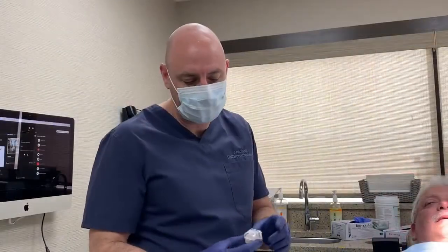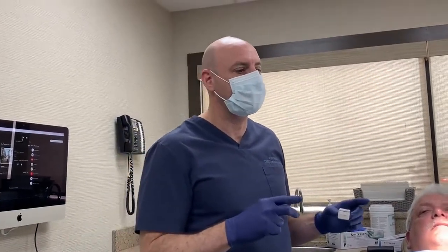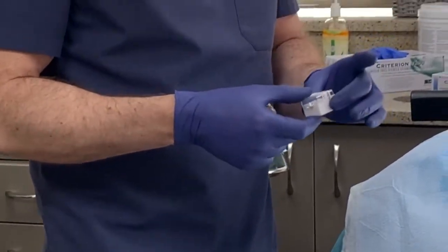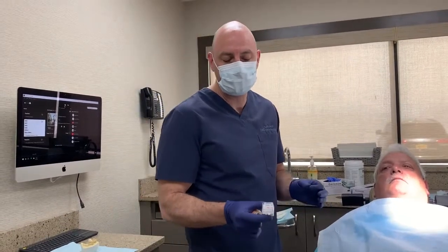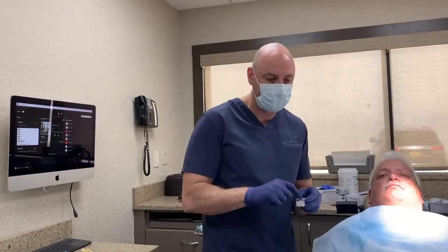What's great about InSequence is that everything is delivered, just like the surgical guides and all the parts and components from the surgery till now. This is delivered in a sealed container of the final screws. I like to call them definitive screws, and I like to call this the definitive prosthesis because you don't like to say anything is really final. But these screws are virgin screws, never been used on the cast and in the lab. The lab uses lab screws, so you're not fatiguing the screws when working on the prosthesis.